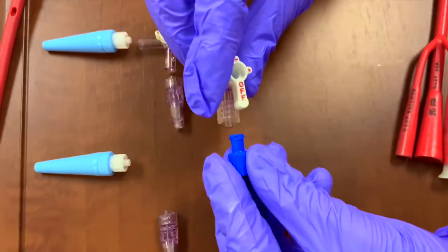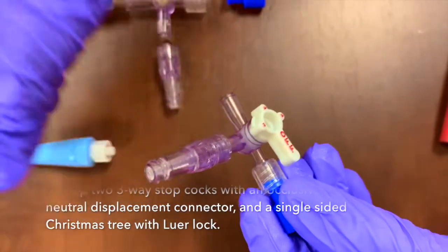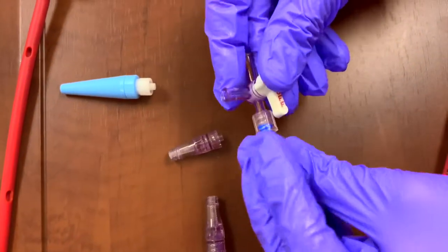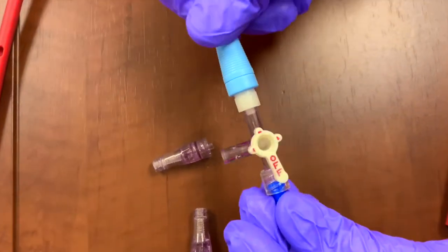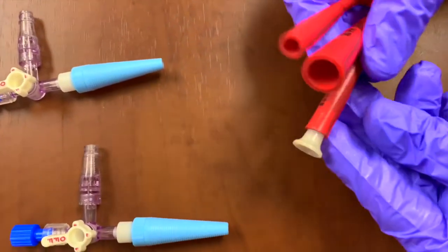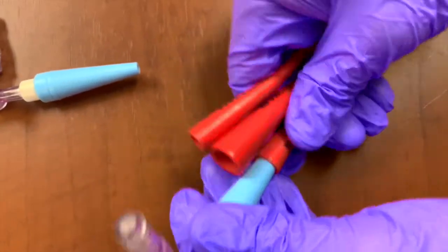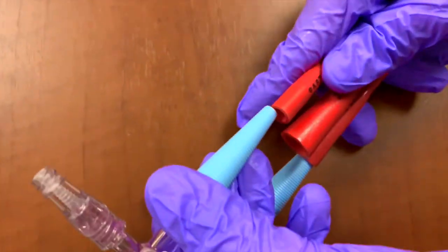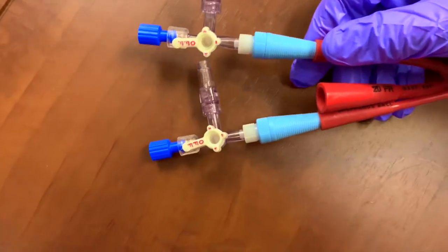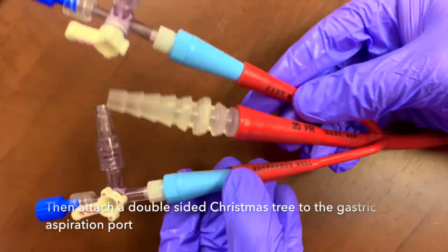Start by setting up two three-way stopcocks with an occlusive cap, a neutral displacement connector, and a single-sided Christmas tree with Luer-lock. Attach the two three-way stopcock assemblies to both the esophageal and gastric balloon ports of the Blakemore tube. Then attach a double-sided Christmas tree to the gastric aspiration port, with the final setup as shown.